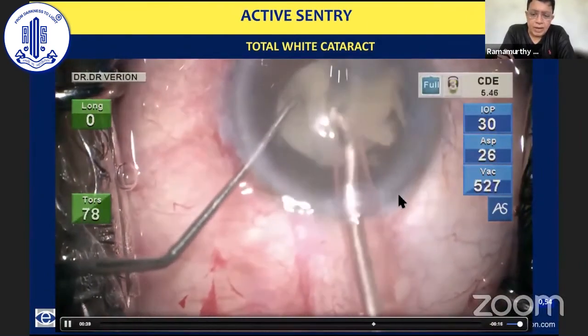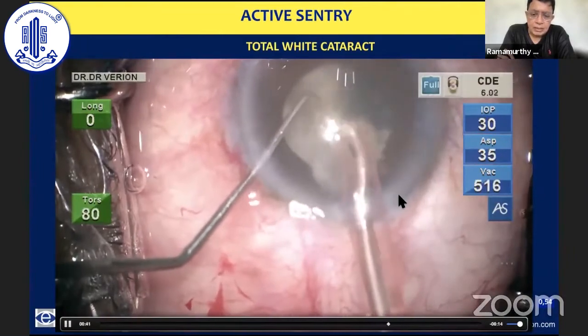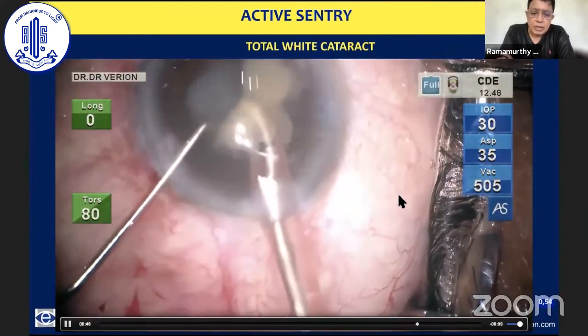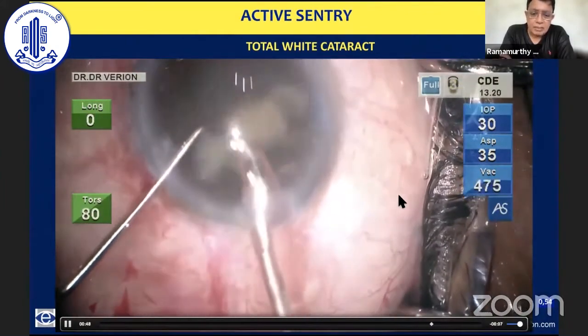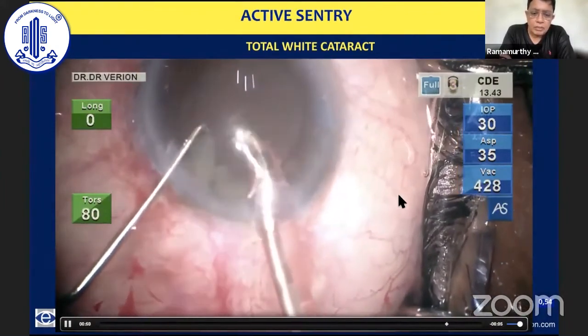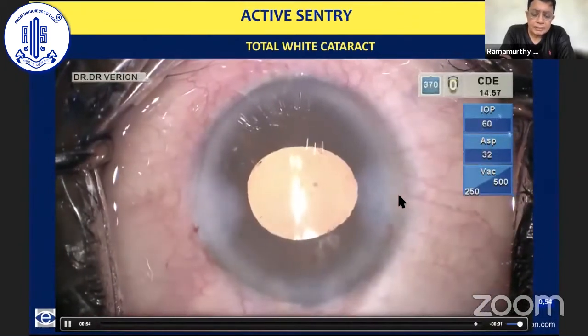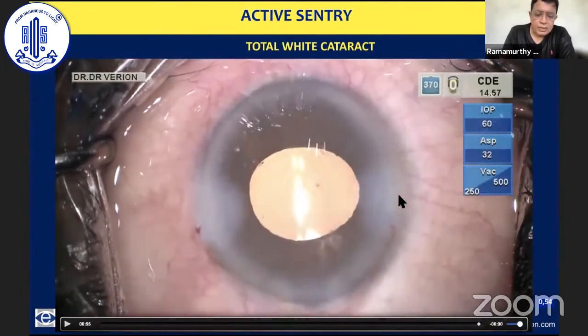Then the fragmentation proceeds in a methodical manner. The chopping proceeds in a methodical manner. Subsequently, with the active sentry being actuated, you go ahead and remove the fragments that have been pre-created and implant the intraocular lens of your choice.